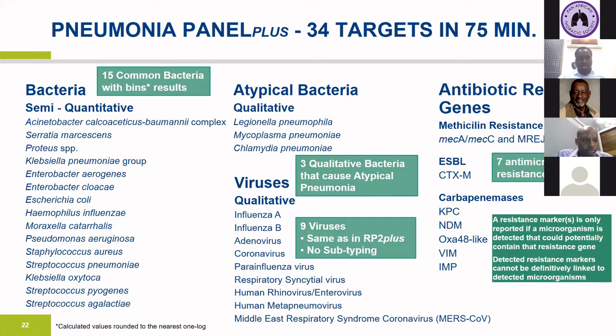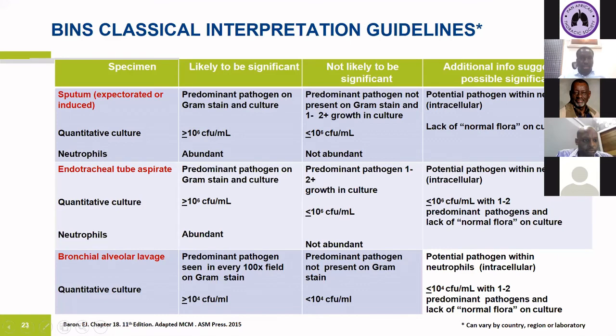And also it cannot be a definitive link to resistance. It is just given as a detection of the gene, and clinical interpretation is necessary. In terms of looking at the log semi-quantitative data for the typical bacteria, again, there's an interpretation that has to be followed.